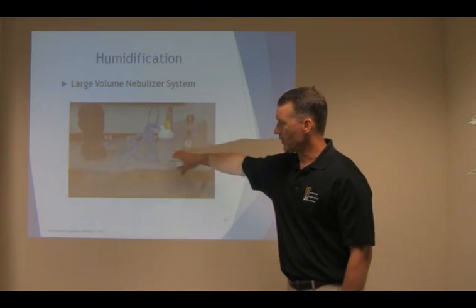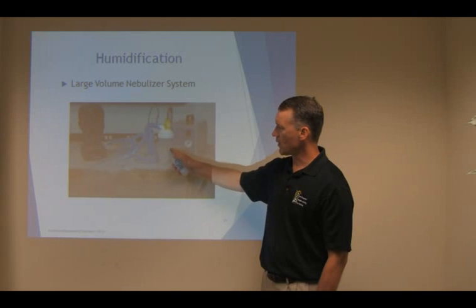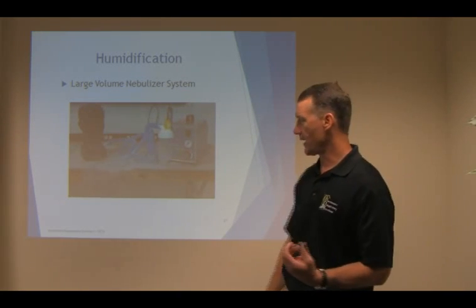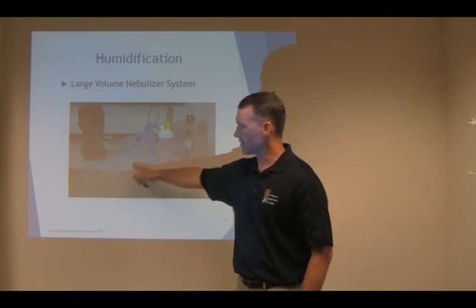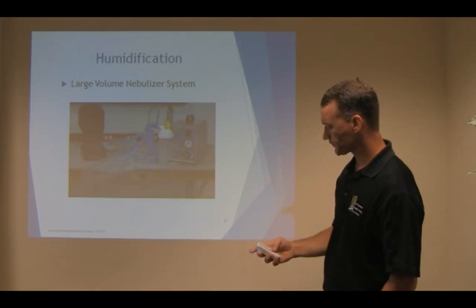Maximum of 20, we've got a large volume nebulizer, and the way this works is it actually pulls water up through this tube, slams it up against a ball inside there due to the pressure, and creates a very, very fine aerosol or mist. We can bleed in oxygen with the U adapter if necessary. Here's our drain bag, and the resident has the trach mask on.